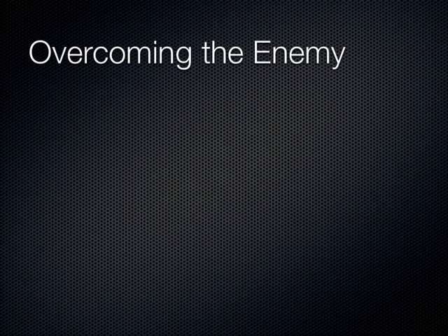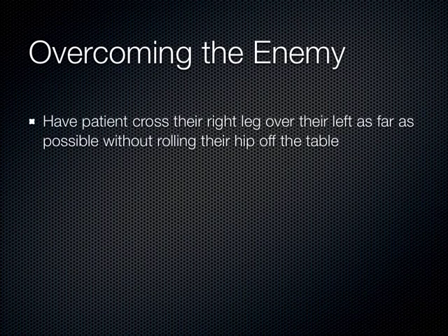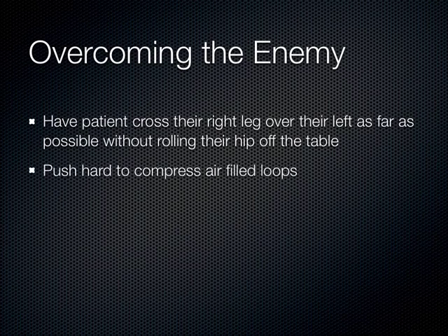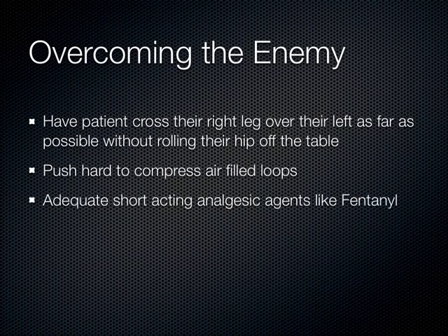To overcome the enemy of bowel gas, have the patient cross their right leg over their left leg as far as possible without falling off the table. Then push really hard — harder in the abdomen than you've ever pushed with an ultrasound transducer.